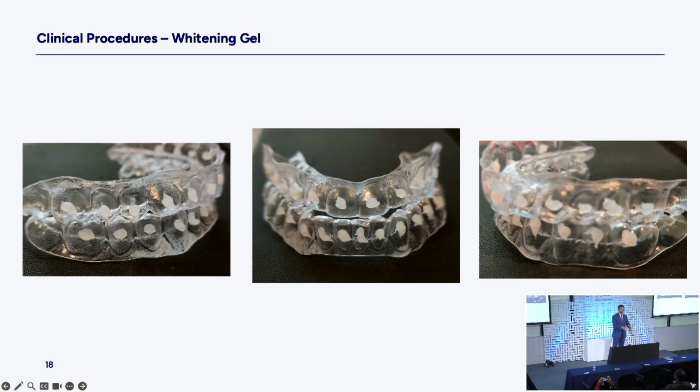So when you're delivering the whitening gel like this, all you do is tell your patient, I'm using the 16% to go after this because it's very nice for sensitive teeth. We don't have much trouble. We teach the patient, you are welcome to do this every single night. We give them a box which has 3 syringes in it. So the 3 syringes will last a 2 to 3 week run if they do both arches. So 3 syringes, and we tell them, you can do this every single night until it's gone. It'll take 2 to 3 weeks to get through. Your teeth will look amazing.